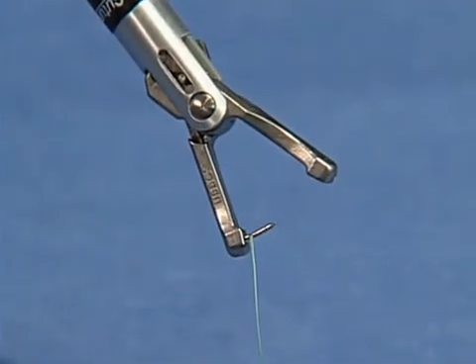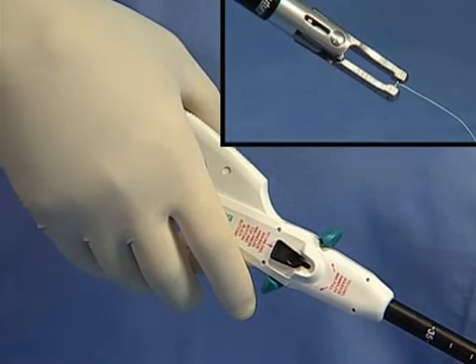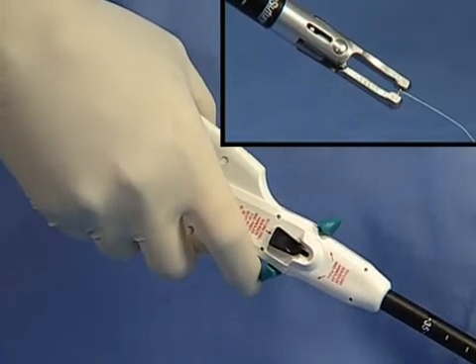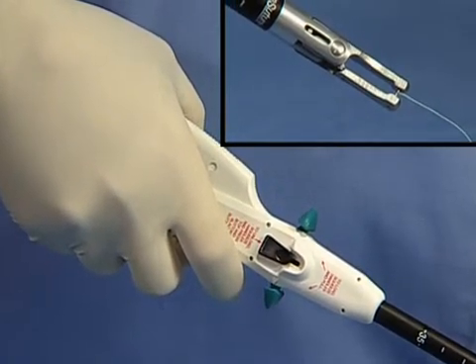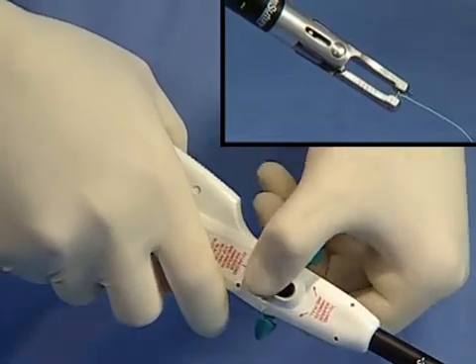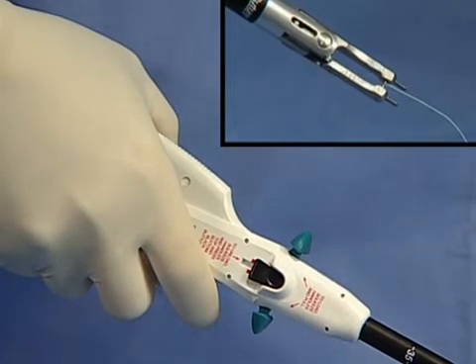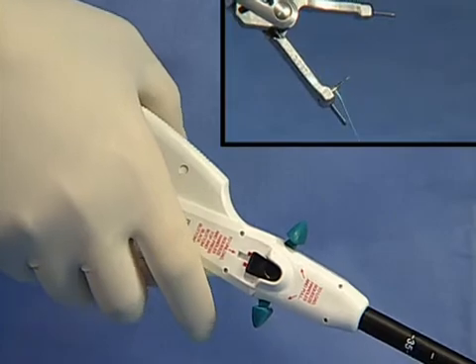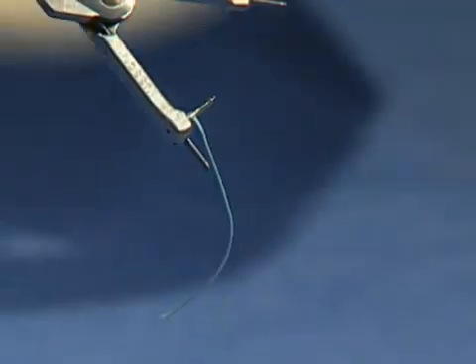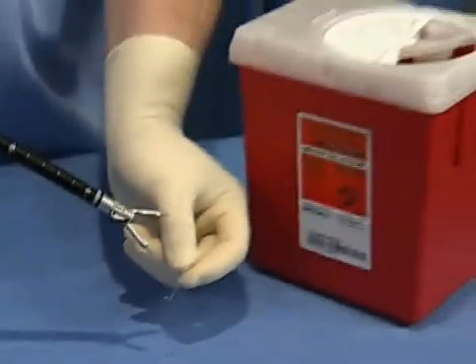Prior to removal of the device, the jaws must be in a closed position. To remove the expended needle and suture, squeeze both handles and align the side toggle levers with the arrows on the instrument body housing. Simultaneously squeeze the handles and press the black reloading buttons on the front and back of the device and slide them completely forward to expose the red indicator boxes. Release the handles, remove the needle, and deposit the expended needle in a sharps container.